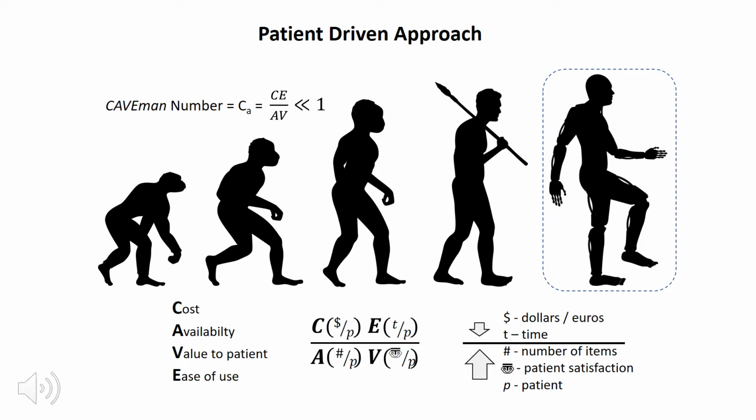The schematic shows the evolution of man walking, from ape to man in his present form. What we're going to is man tomorrow, which is some sort of combination of stimulation with an exoskeleton. I'm convinced that the two will eventually lead us to the goal of a satisfying walk that will allow people to have mobility in their everyday movements.